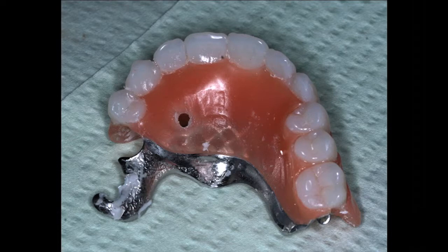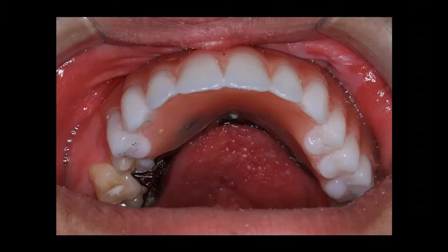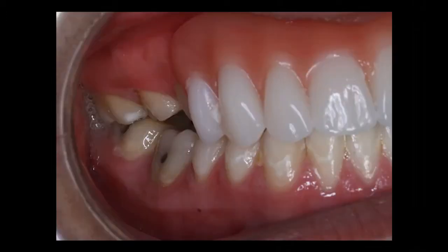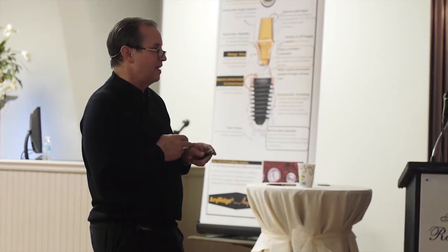Then we're going to go ahead and cure those attachments in the mouth. And we got 3 yellows. These are the bar attachments because we made a bar for them. And this is just the final result. The occlusion is not what it could be, but it's kind of like the best we could do. I mean, this guy's like on cloud 9. He takes good care of it. It's just another instance of where implants can really help some people out that are really kind of a mess.